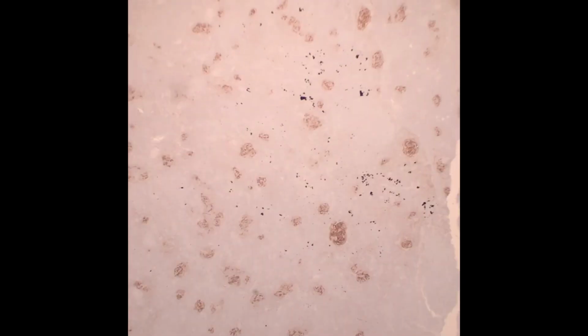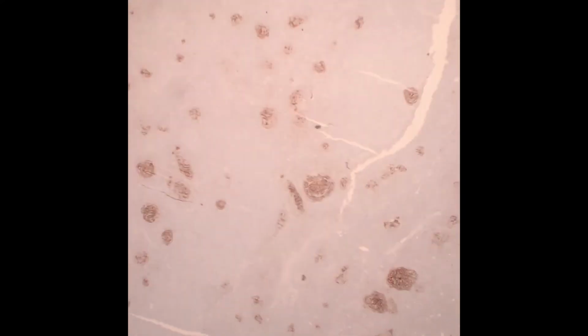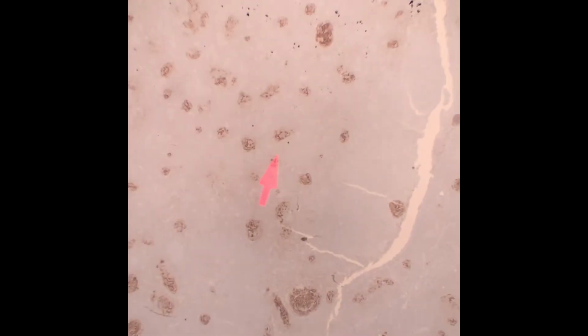Interestingly, this is a CD21, and I think it very nicely highlights that there's a large number of small follicular dendritic cell meshworks. They're fairly tight in some areas over here where we saw the benign follicle, and some of the other ones look fairly disrupted.